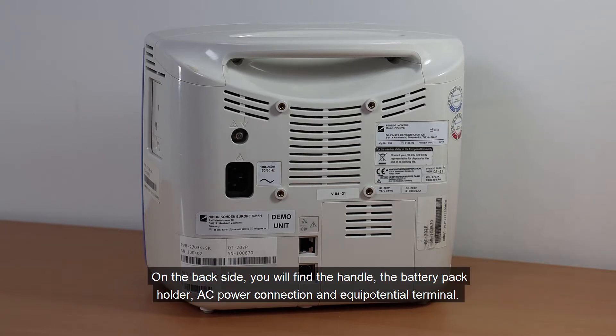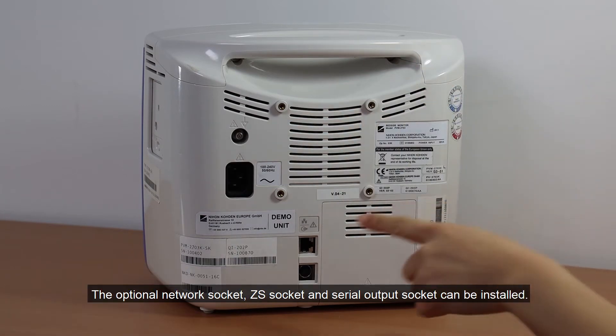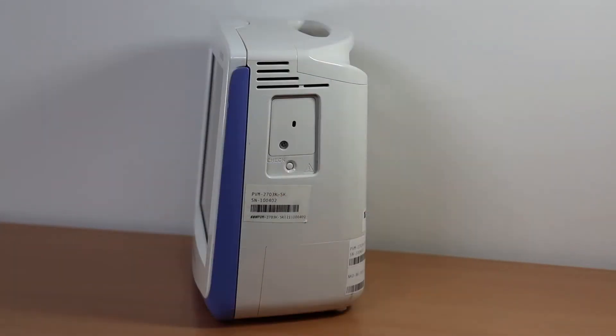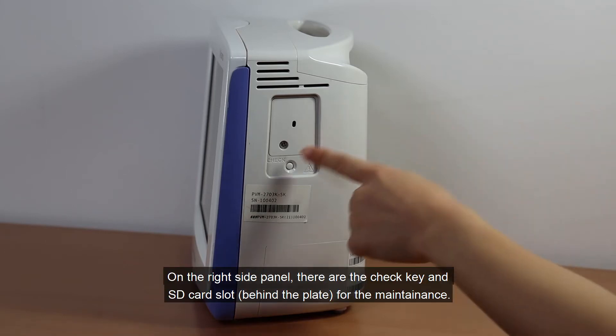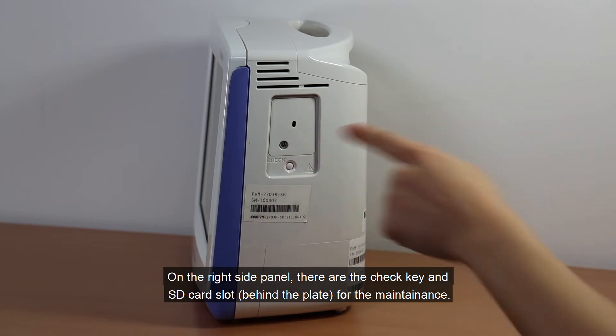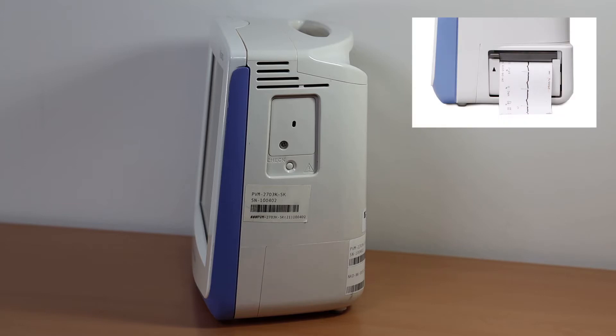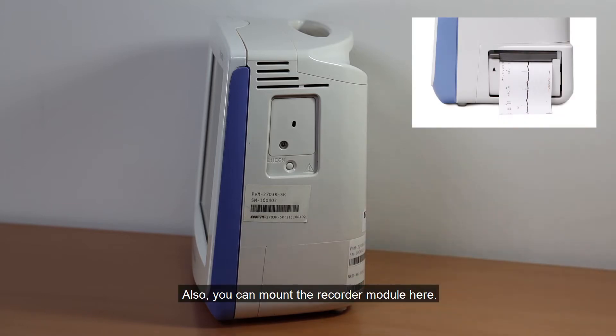On the back side, you will find the handle, the battery pack holder, the AC power connection, and equipotential terminal. The optional network socket, ZS socket, and serial output socket can be installed. On the right side panel, there are the check key and SD card slot for maintenance. You can also mount the recorder module here.